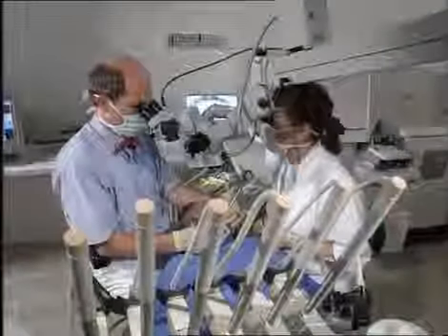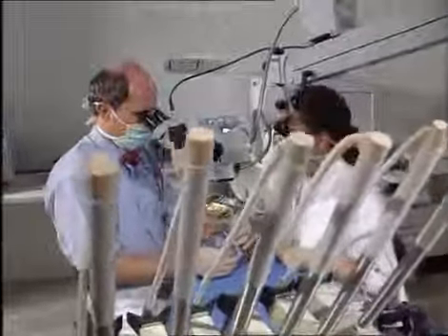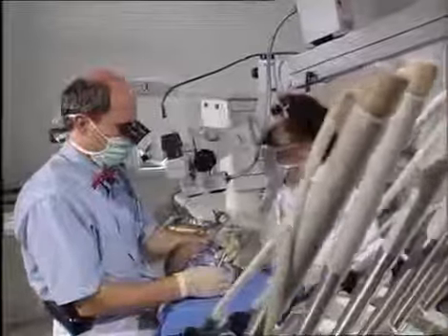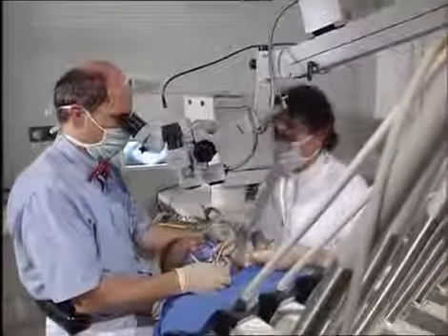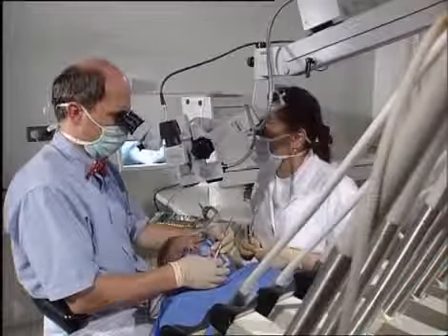Endodontics has changed dramatically during the last years, due to the development of new instruments which make cleaning, shaping, and obturation of root canal systems much easier, as well as the introduction of the dental operating microscope. Based on the classic Schilder philosophy, we can enjoy today a treatment concept which guarantees endodontic perfection and predictable long-term success, if done properly.